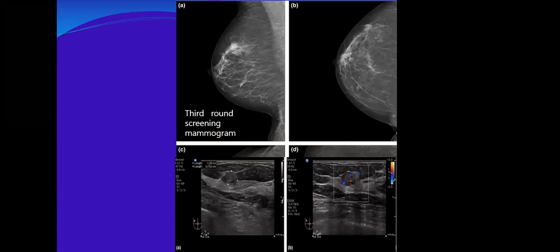At the right lower part of the mass, I did not see a cutting sign, but from this it is enough. Being heterogeneous, with hypervascularity, there is moderate intralesion vascular signal, and indistinct irregular margins is enough. I will make it BI-RADS 5. I will go for BI-RADS 4C.